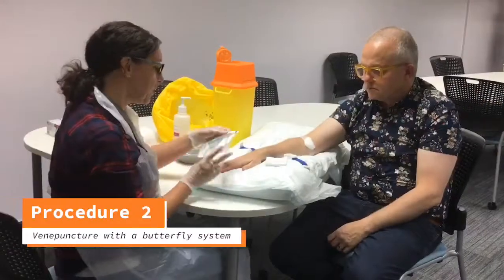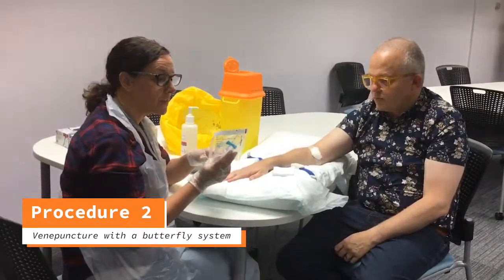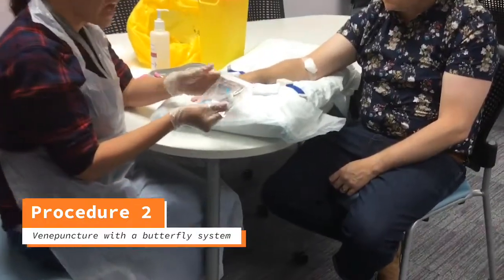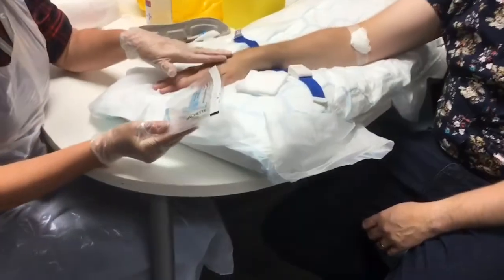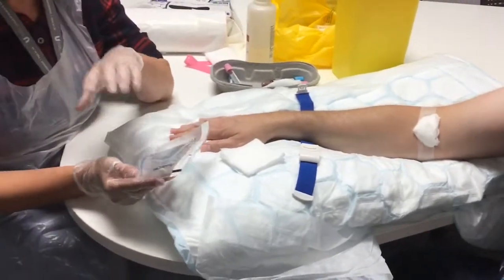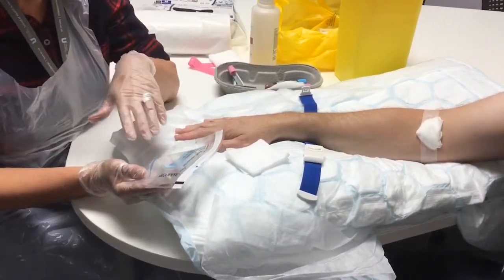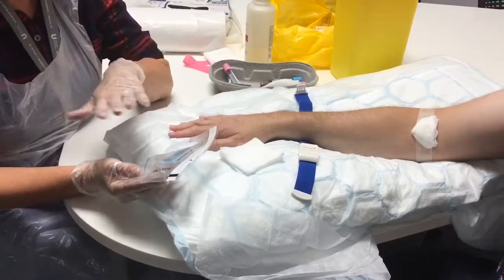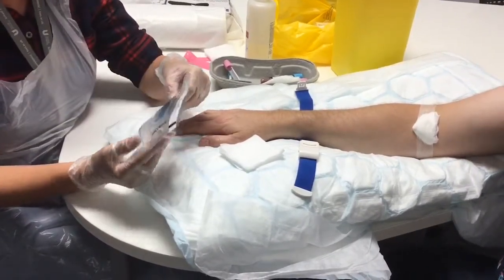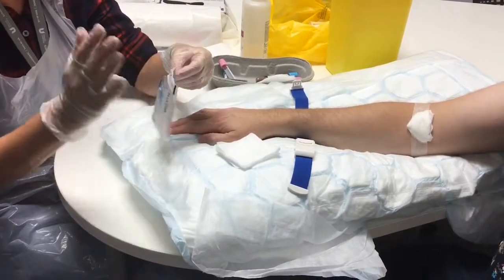Now part two. I'm going to use the butterfly device with the vacutainer on, which you'll see in clinical areas. You can use this not just in the back of the hand but also in the antecubital fossa — people use it in all different areas. It's really a preference of equipment unless your policy states you have to use a certain piece of kit. As long as you're safe and competent, that's the key thing.